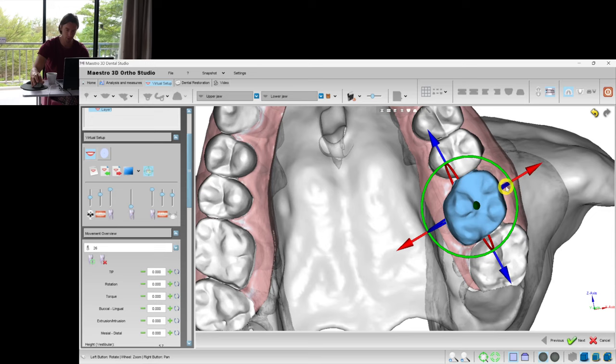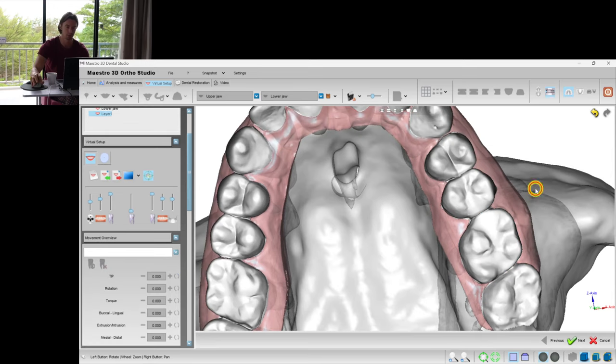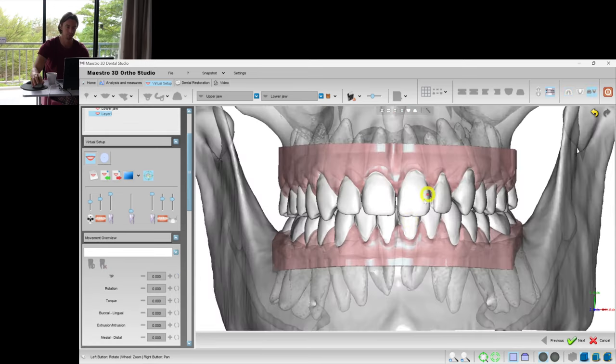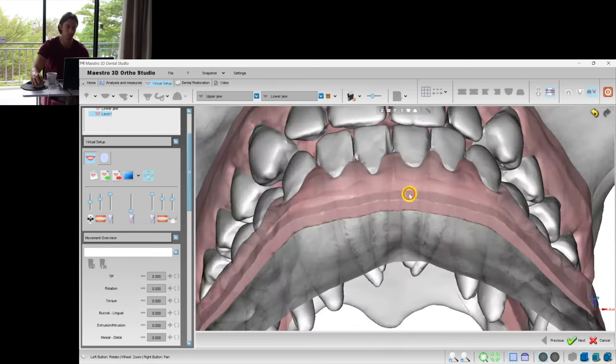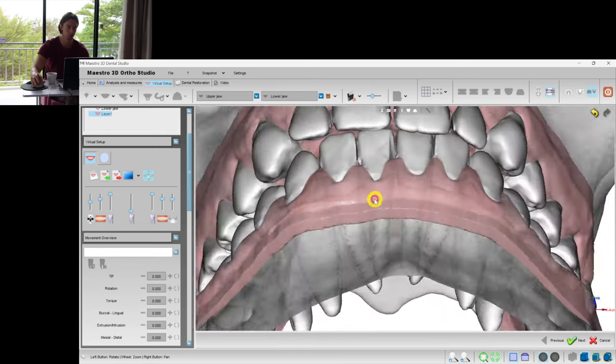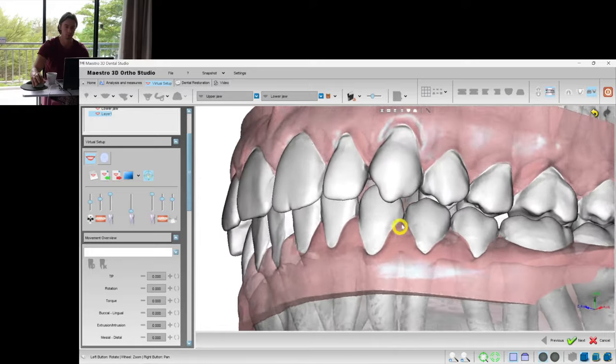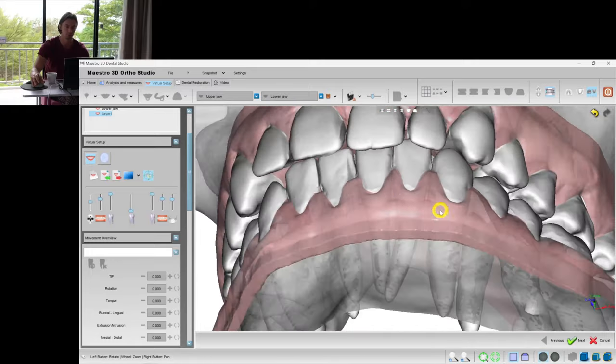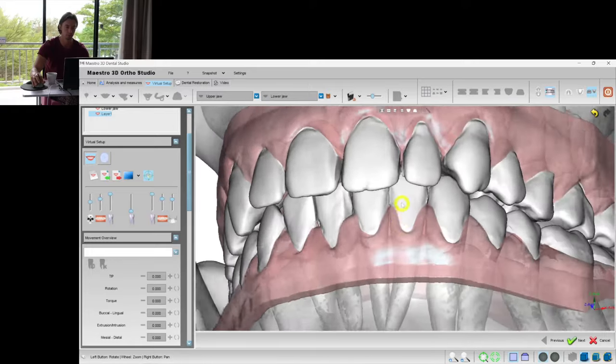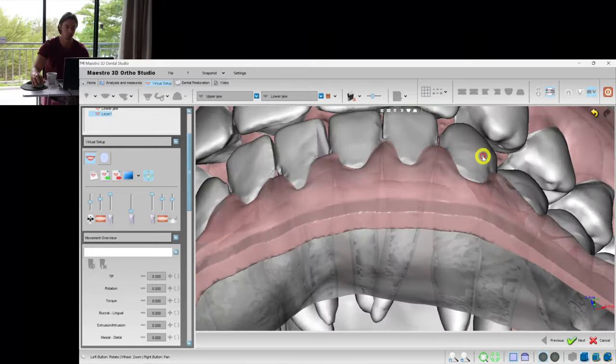Some minor expansion, and let's check the occlusal contacts. Yep, we have no collisions.